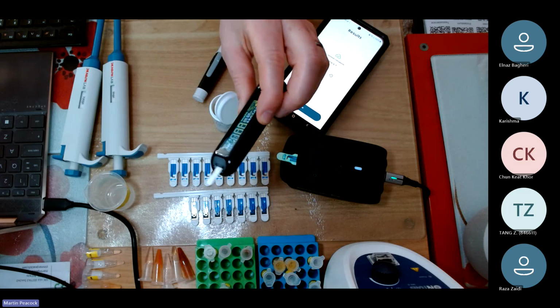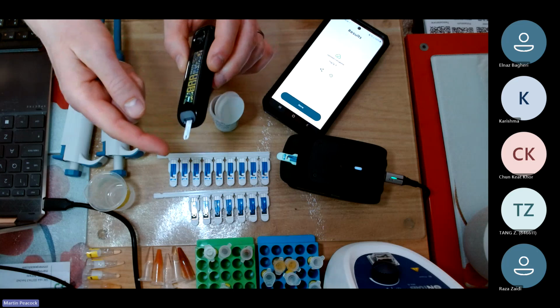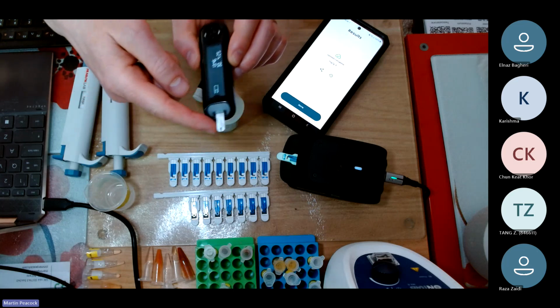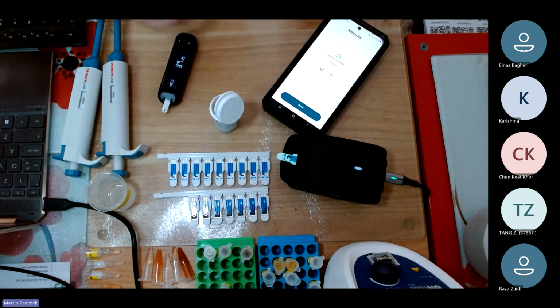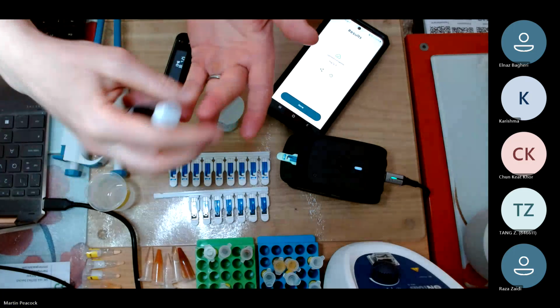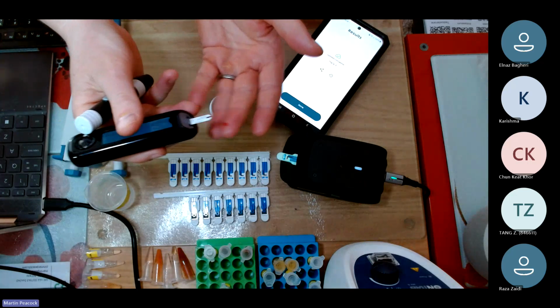What that's demonstrating is that electrochemistry or screen-printed electrodes are a good choice for scaling electroanalysis. And electrochemistry in general is a good technology because you can make these low cost meters. Now, I'll demonstrate the sample prep, which is to take some blood. So there's effectively no sample prep.